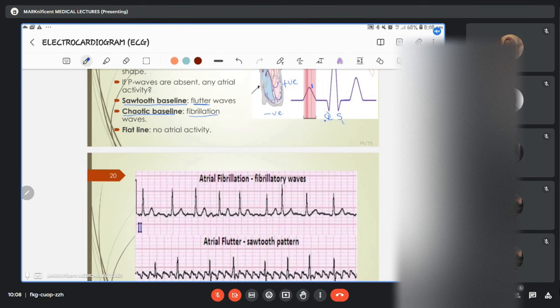When you hear sawtooth, there is this tool that those who repair or fix furniture use to cut wood. It is normally like this, and then maybe the handle is here. This is called a saw. Use it to cut wood, use it to cut some other things. So the sawtooth appearance is what the P wave will give you.